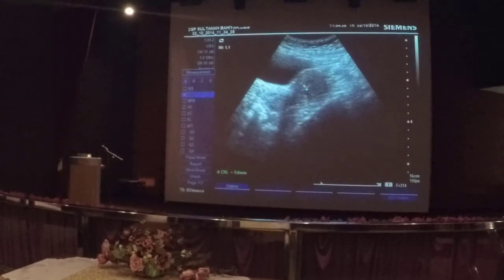So the reason is because when we twist it the wrong way, the orientation is reversed, so the image is also reversed. Sometimes we also get confused when interpreting. But otherwise, is it normal? The bladder, the uterus, the endometrium look normal, the cervix looks normal at a glance.